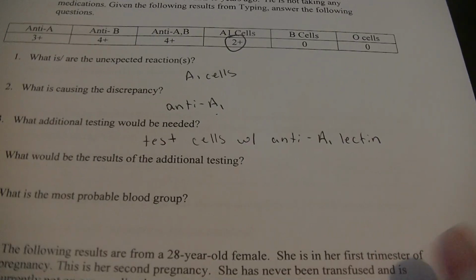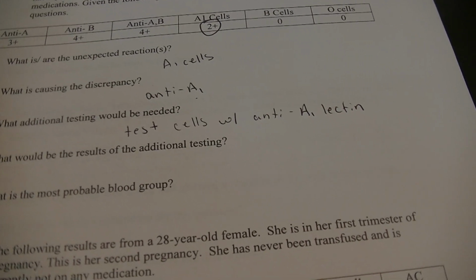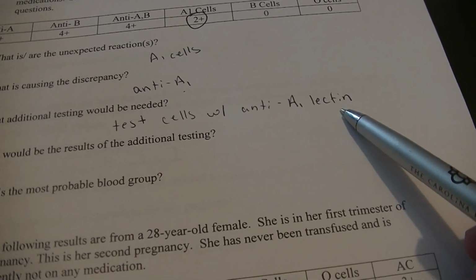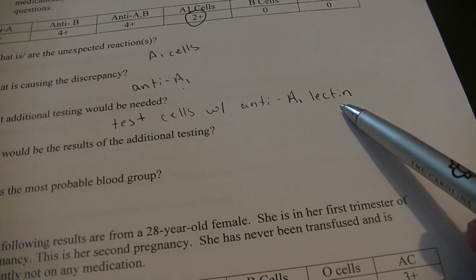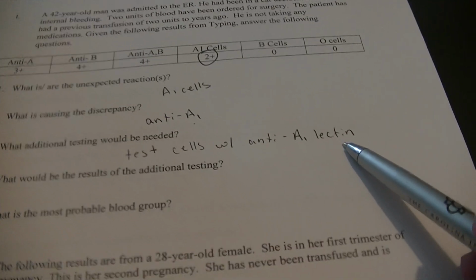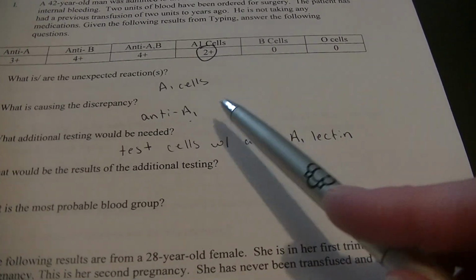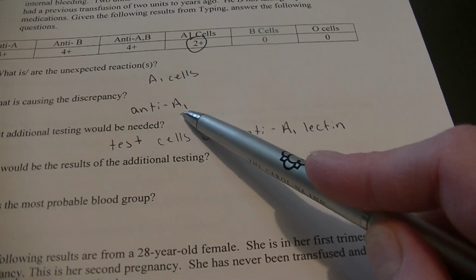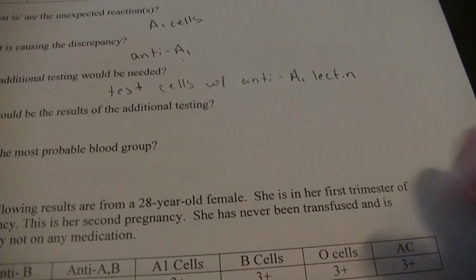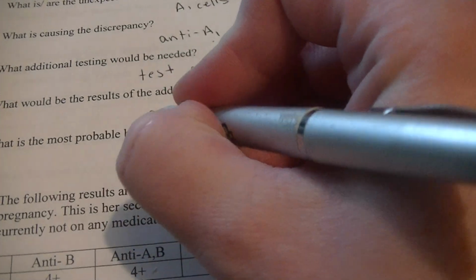If this person is a subgroup of A, such as an A2 blood cell type, they would not have agglutination with A1 lectin, confirming that they are not A1 for their A antigen. If they do not have the A1 antigen on their cells, they can absolutely make an anti-A1, which would react in the reverse grouping. So what would we expect the results to be of this additional testing?